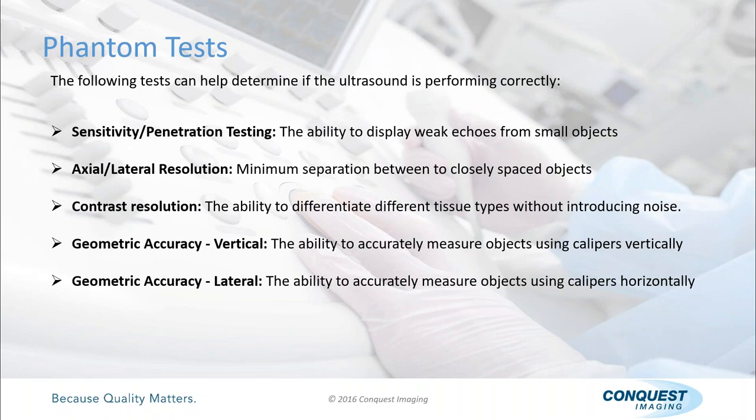If that's the case, change to an adult preset, if you will, and check your calipers again. I bet they come into spec. I like to point that one out because it took me 2 weeks to figure it out. Me and another guy, back and forth over the phone. Both of us had lots of experience, and none of us had ever seen it. And it got down to the preset they were using.